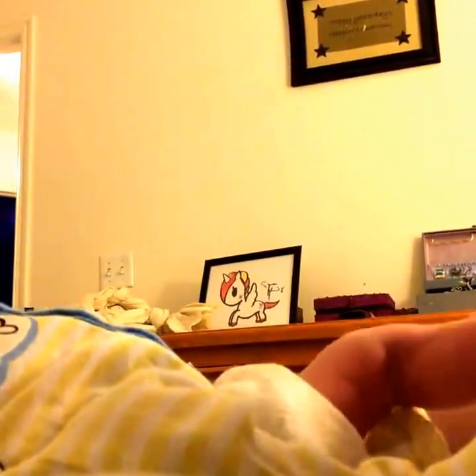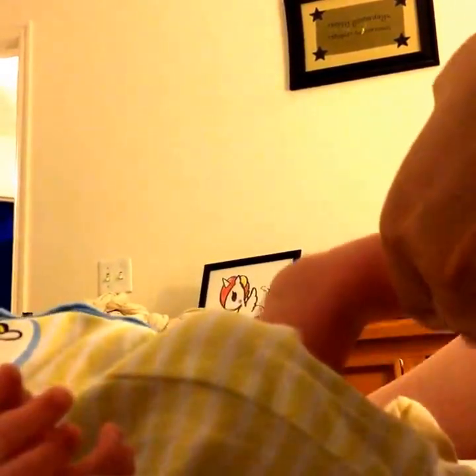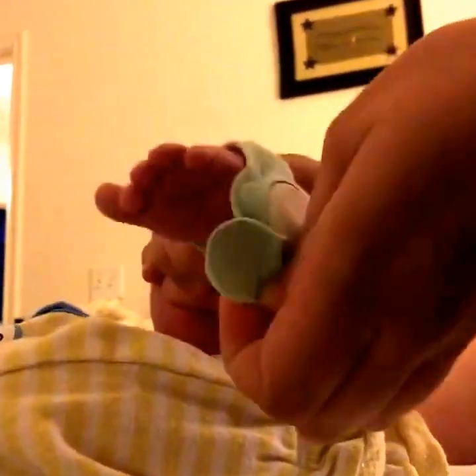The newborn sock actually goes upside down compared to all the other socks, so that confused me for a little bit. I had seen pictures of it and the sensor was on top, but with the newborn sock the sensor needs to be on the bottom — I think just because of the size of the foot.